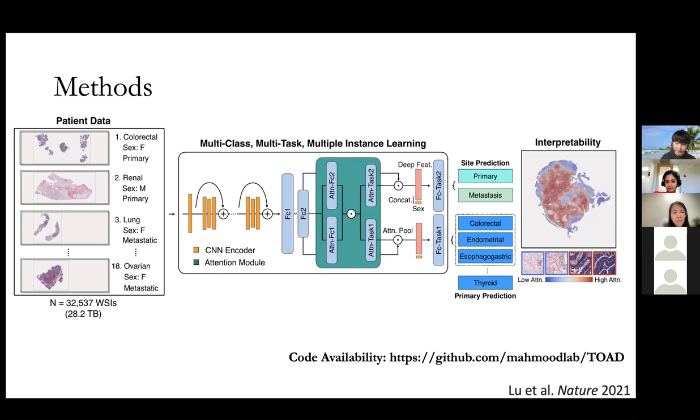So in practice, what I found is that I would always just run the baseline, so straight up attention multiple instance learning with embedding. You can do tricks like dropout both on the intermediate layers as well as the attention scores, and also make the model larger and wider, and that typically can give you better performance. And if that's still not enough, then by all means try this technique as well, and see if you can get a little bit more out of it. But yeah, that's basically how I view it.